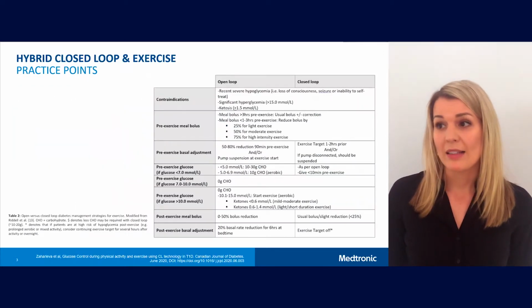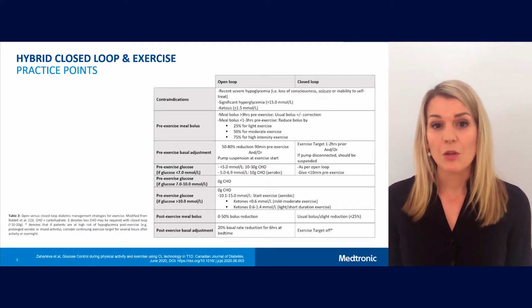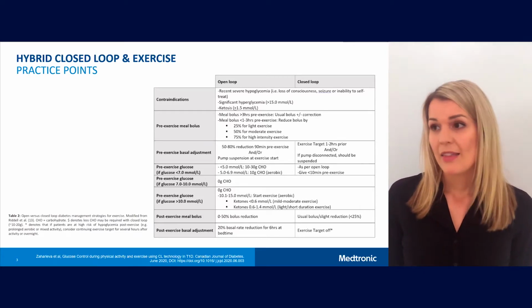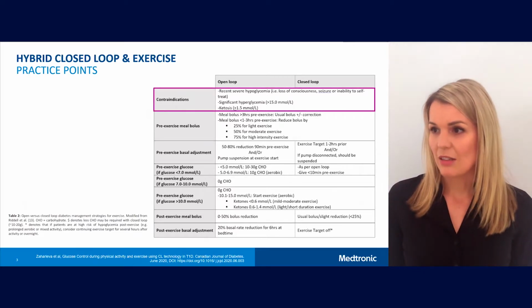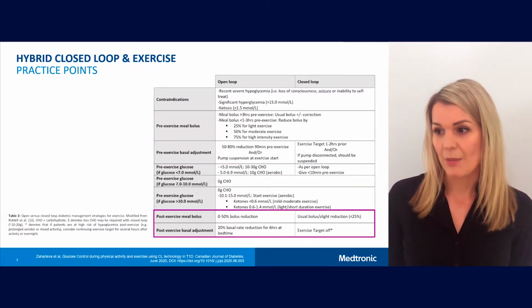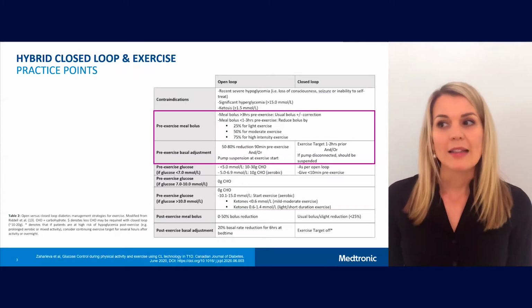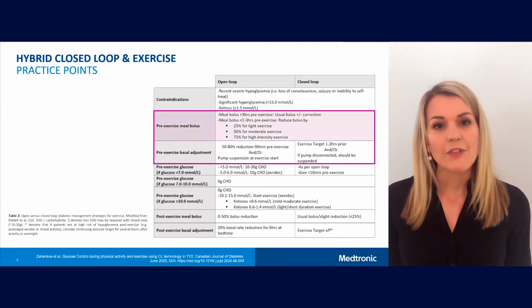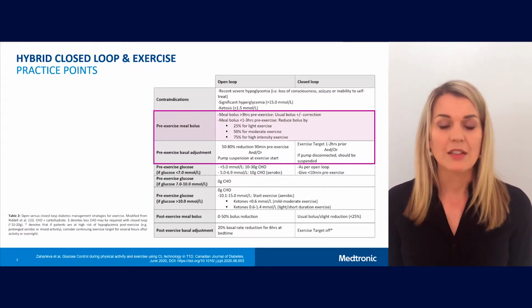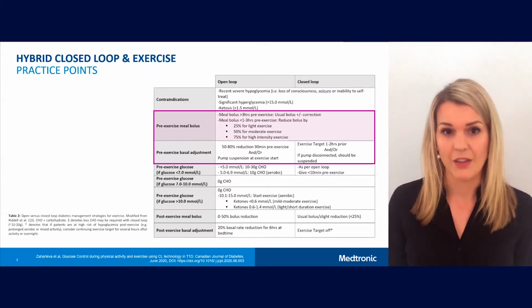This table summarises some of the exercise strategies that can be used in open loop or conventional pump therapy and hybrid closed loop. They are divided into contraindications, pre-exercise insulin adjustment, pre-exercise glucose aim, and post-exercise insulin adjustment. Starting with pre-exercise bolus adjustment: if a meal is to be consumed 1 to 3 hours before exercise, a reduction of 25 to 75% is recommended for both types of therapy.